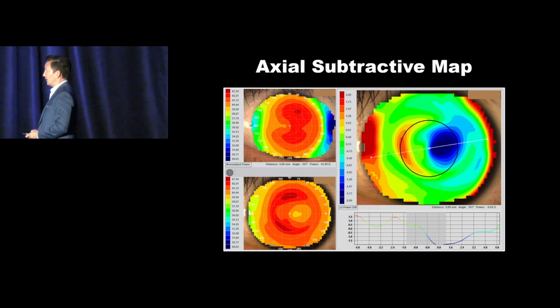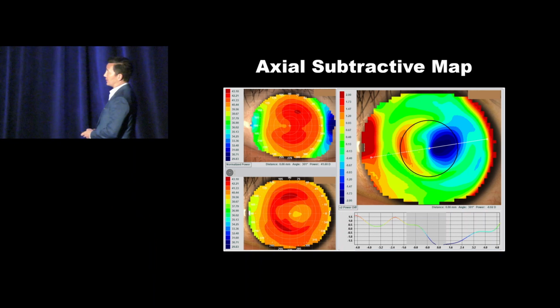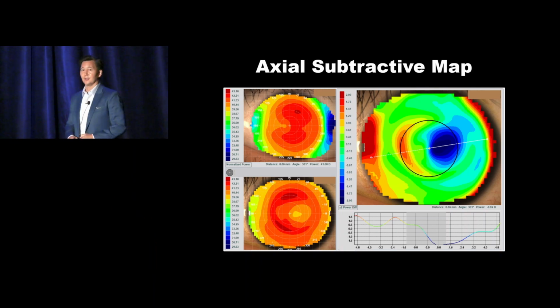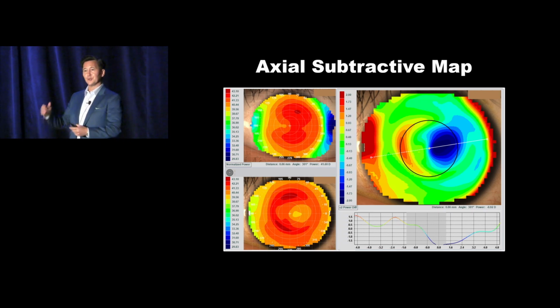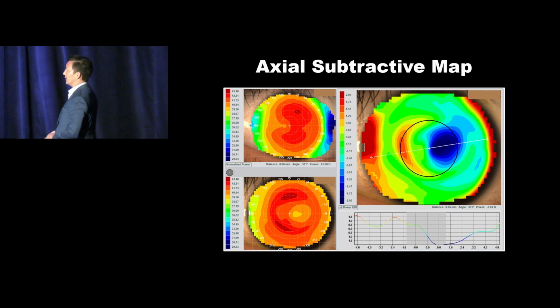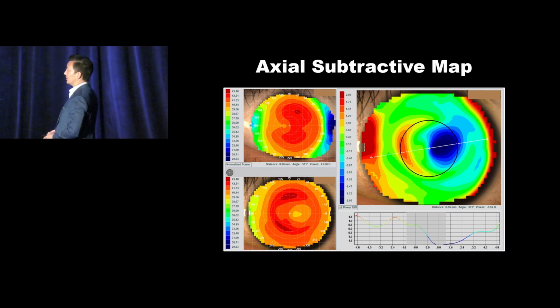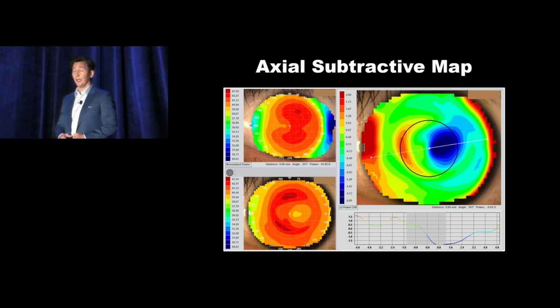The final is your lateral displacement. And you might check your baseline topography to make sure that you have a lens that's not following natural eye displacement. In this case, I look at that green-yellow border, and it looks kind of symmetric with the center. It looks pretty equidistant here to the green as here to the green. So I don't predict that the lens should be riding significantly temporal on this left eye. So why is it? Probably the lens is way too loose.